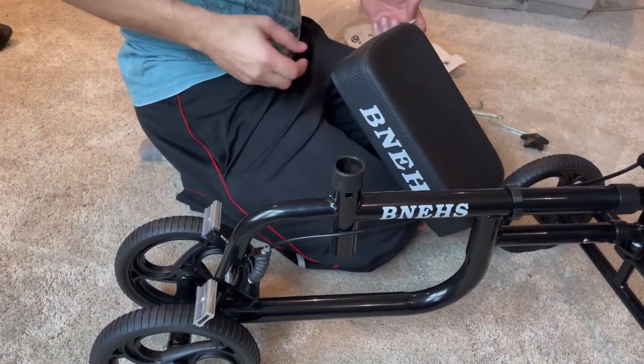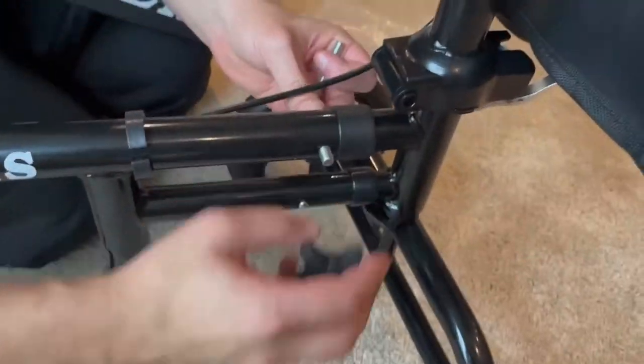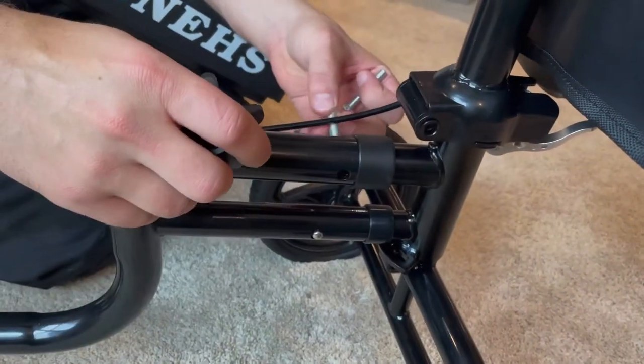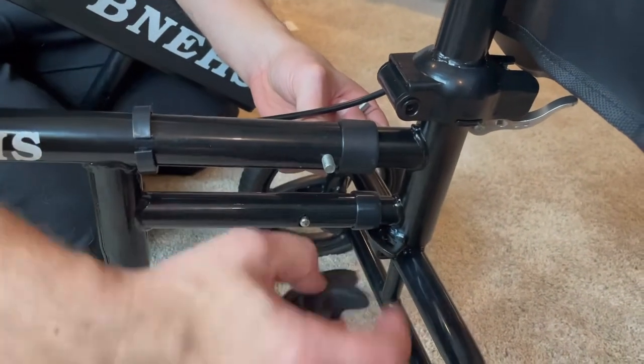On the rear wheels, notice that the brake pads are going to be made with a thickened, grooved brake pad, which allows for better control on the rear wheels, as it will prevent them from slipping or breaking.